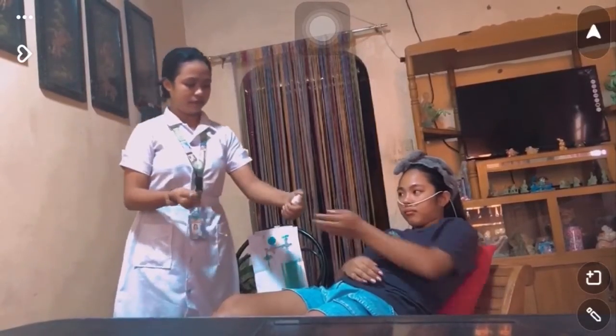Okay, so ma'am, for the last time, do you feel any pain or irritation? No. Are you comfortable at all? Yes. Okay, so after that, we need to do the hand hygiene again.